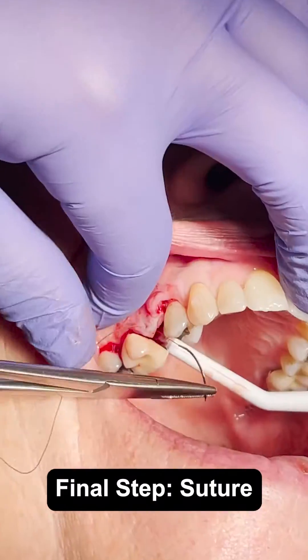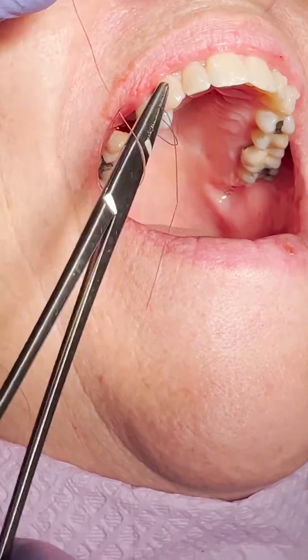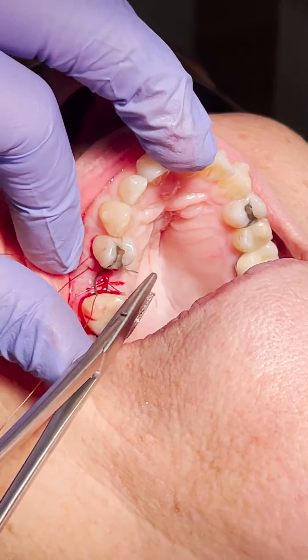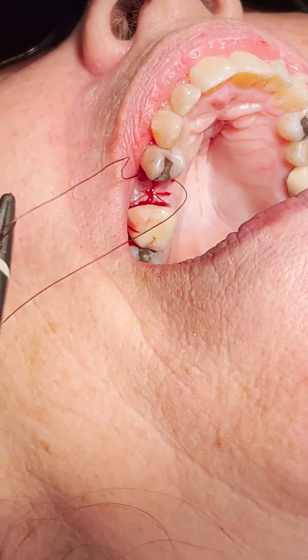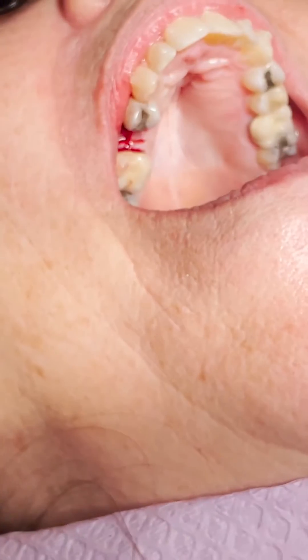I'm going to suture this pretty quickly with some interrupted sutures. When David Wong was here, he takes his time suturing, making sure to put in as many sutures as needed. I guess that's the difference between good and great — that guy's a beast and gets really great outcomes. So when you're grafting, definitely pay more attention to suturing.